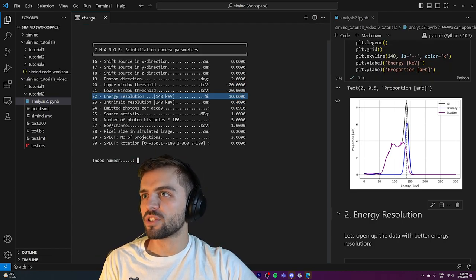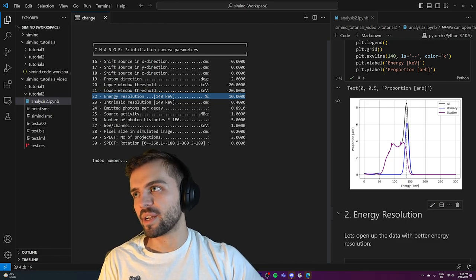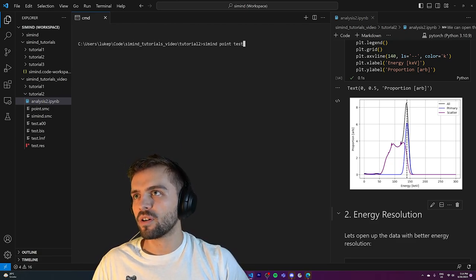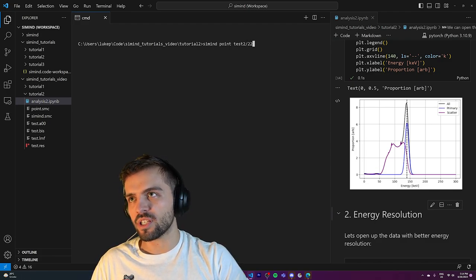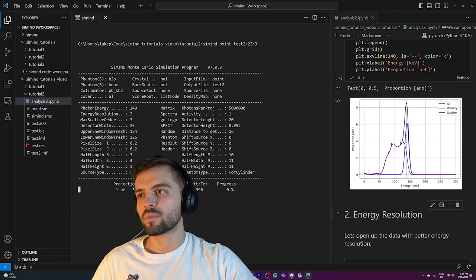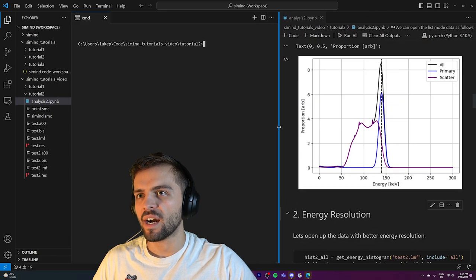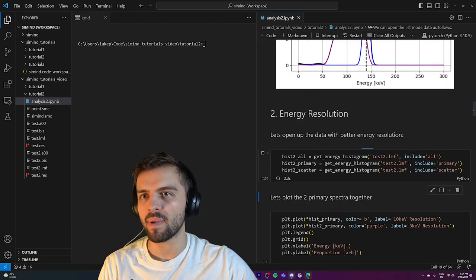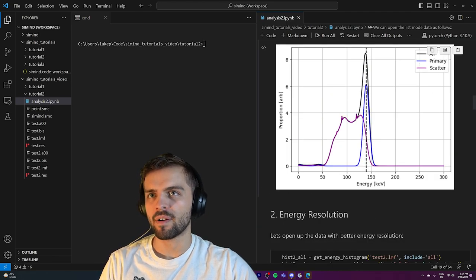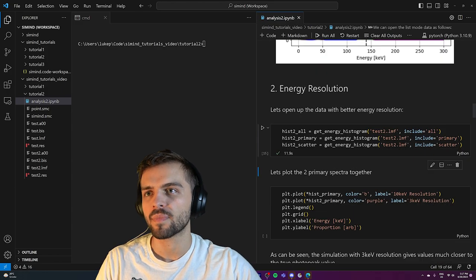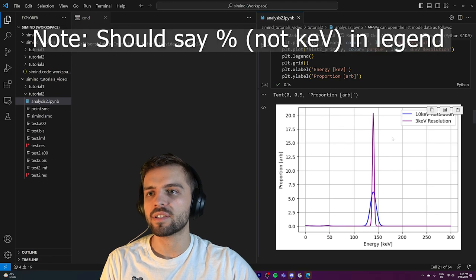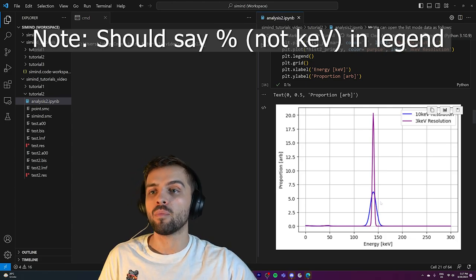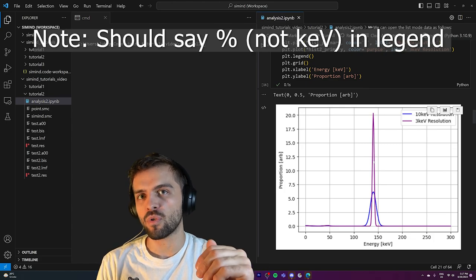There's going to be error in where the photon is assigned its position. What we'll do is change index 22 to a value of 3 and rerun. I call simend point test2 and set index number 22 to 3% — now it's going to be 3% resolution. The simulation took about two minutes. We now have the higher resolution data with 3% resolution as opposed to 10%. We can open up the same histograms with the better resolution file and plot the two primary spectra together.